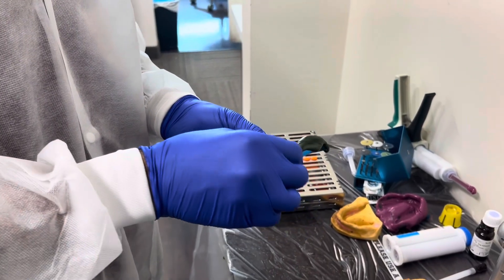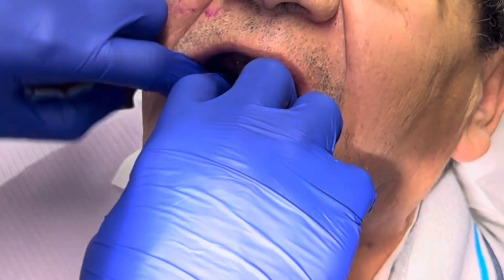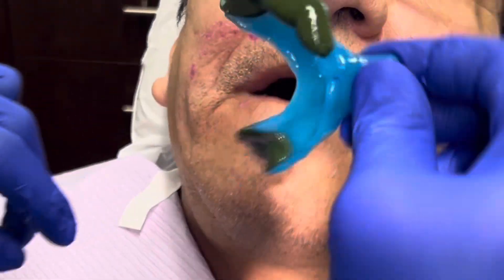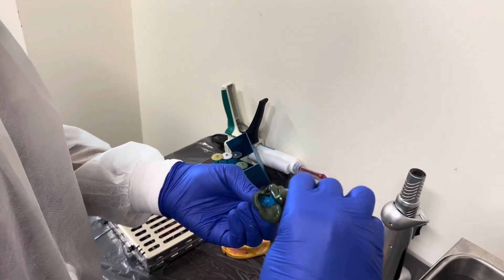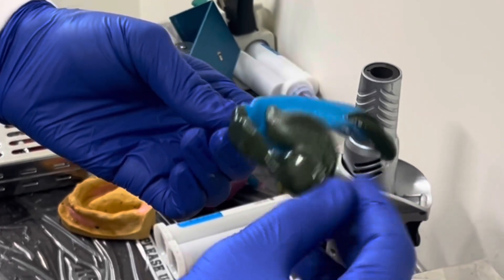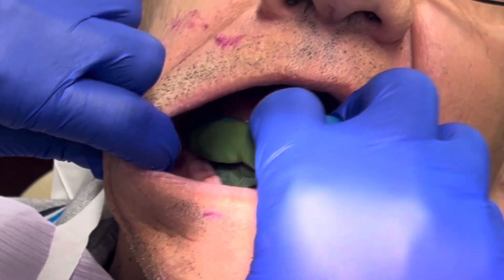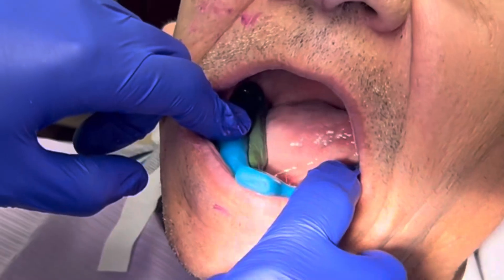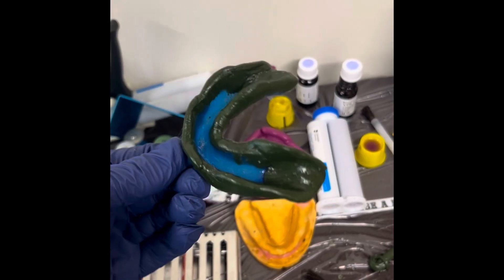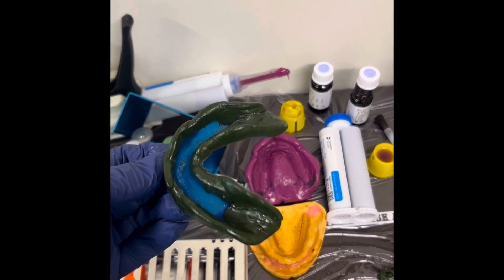Now we're going to heat up more green stick compound and apply it onto the buccal area, seating the tray one more time to border mold the buccal area — not hard, but just making sure there isn't any tissue trapped underneath the tray. We then add green stick compound onto the lingual vestibule area, contouring it appropriately. When seating the tray, make sure the green compound does not fold over itself, then ask the patient to stick their tongue forward and left and right, which border molds the lingual area. The contralateral side is completed, green stick compound is trimmed on the inside except for the retromolar pad areas, and adhesive is applied.